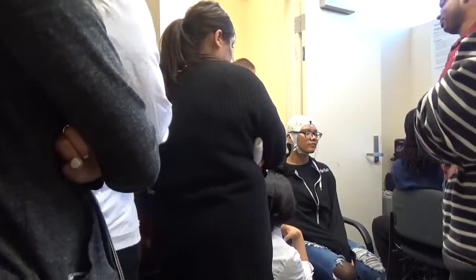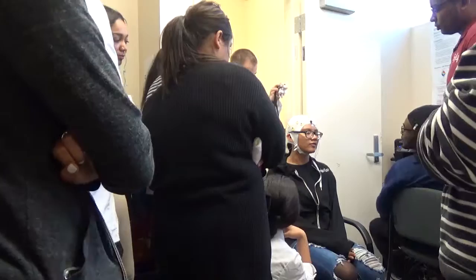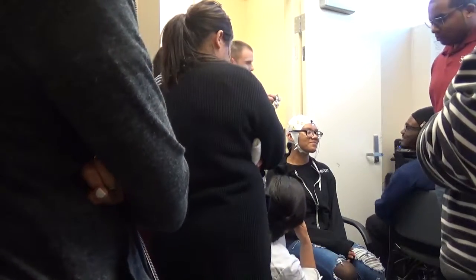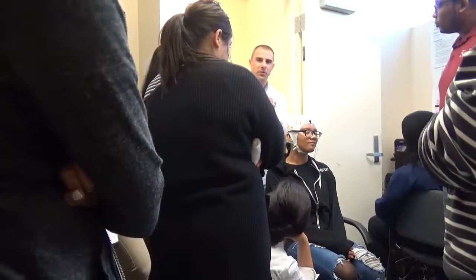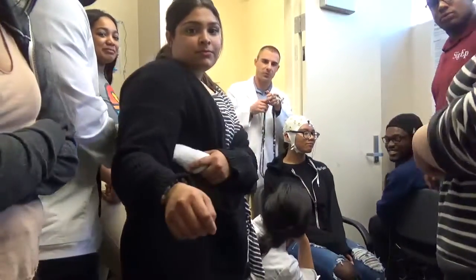So can the participants have their eyes open during this time? Oh no, I prefer to have my eyes closed. Are you kidding? She just did. That's fine. You can bring the camera in a little closer if you want, just so you can see it.